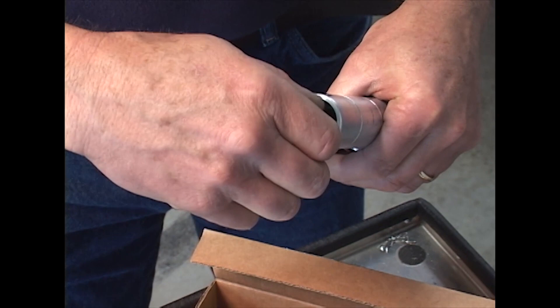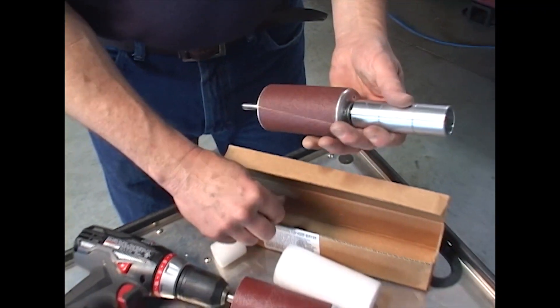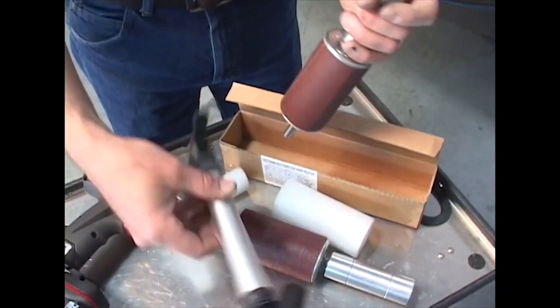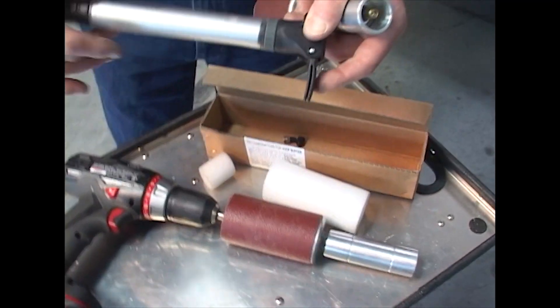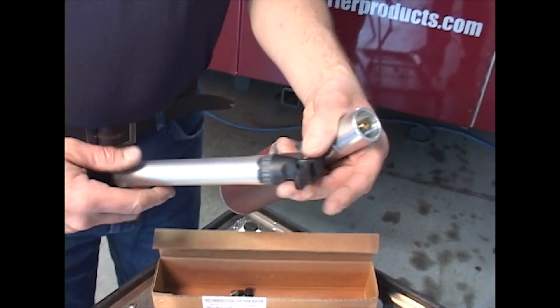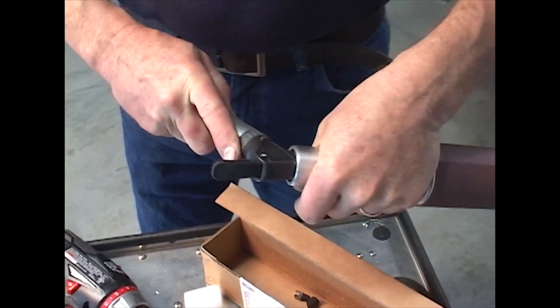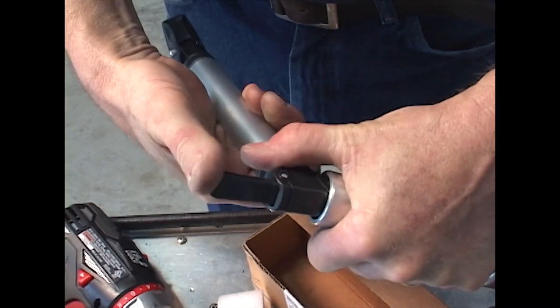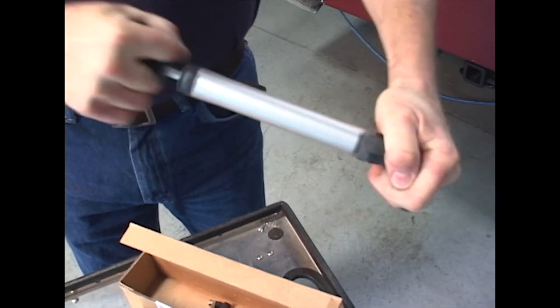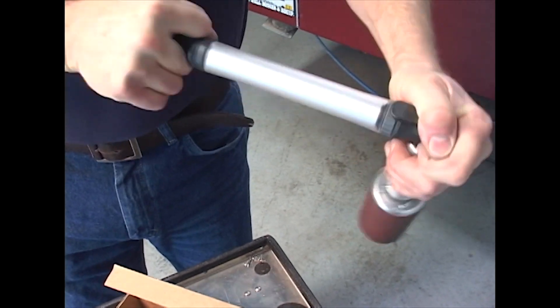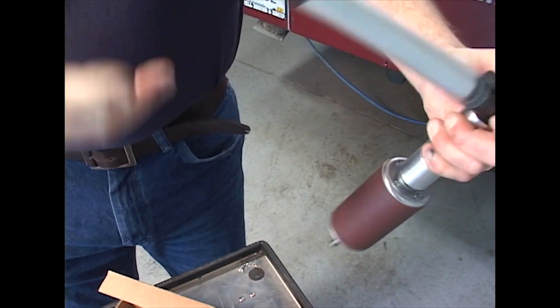We're going to inflate this unit using a bicycle pump, just a Walmart unit, nothing specific. It just has to have enough clearance here so that it fits firmly over the stem, and you pump it so that you have enough pressure in there to your liking.